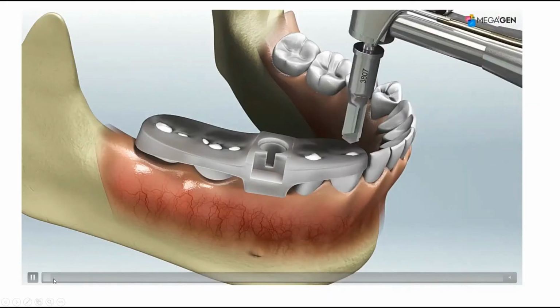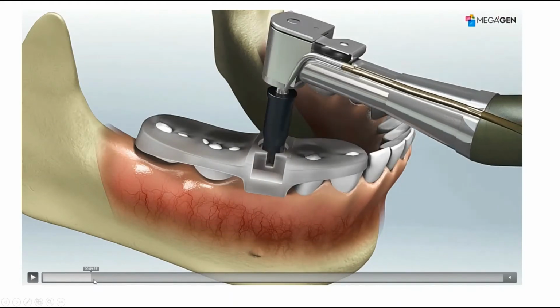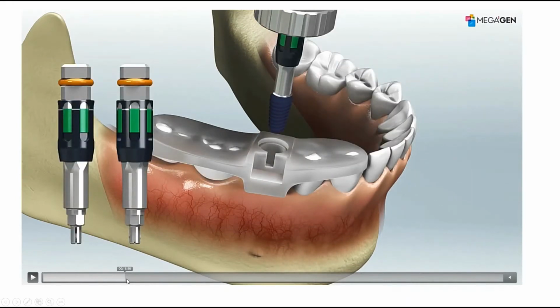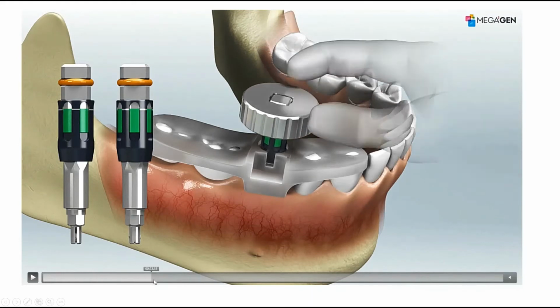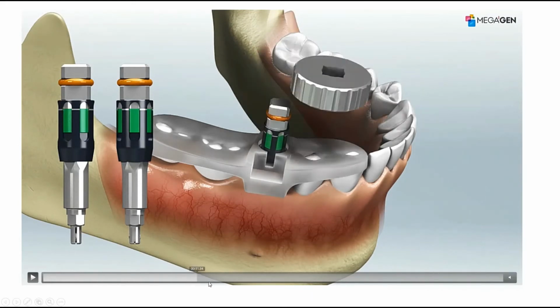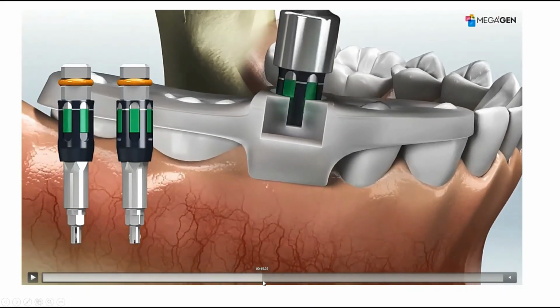In this video, we're going to be using our surgical guide for drilling. So right now, I'm drilling directly through my surgical guide. And now when it comes to the implant placement, I'm placing my implant through the surgical guide. I prefer to place the implants first by hand, and then I place the implants with the handpiece.